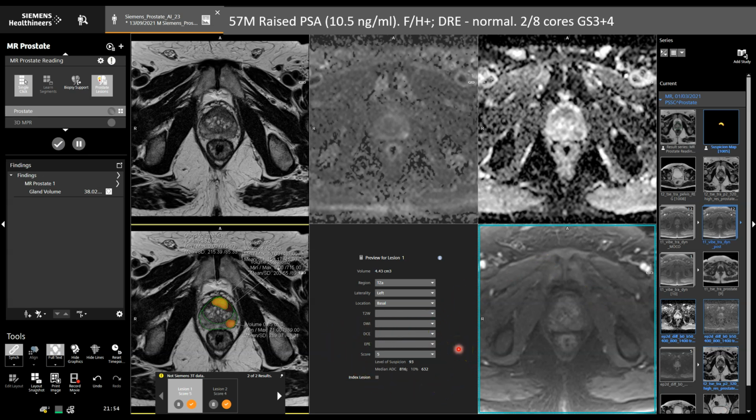Right. Now, the radiologist still reviews all that. They can edit findings, accept or reject them. Still in control, ultimately. Still in control, but the AI does more of the upfront work. And it facilitates exporting that lesion info directly for biopsy planning systems.